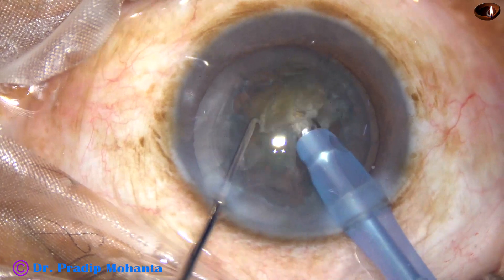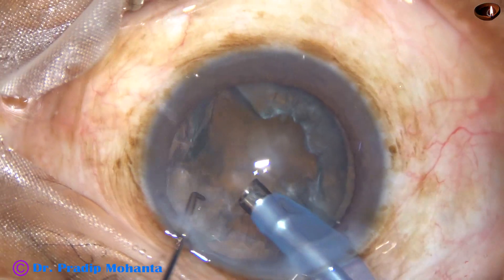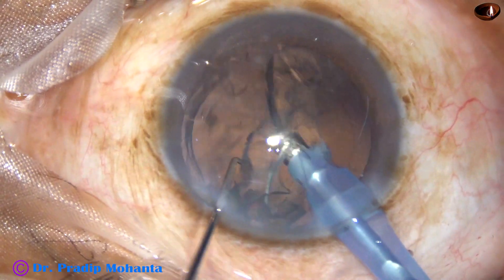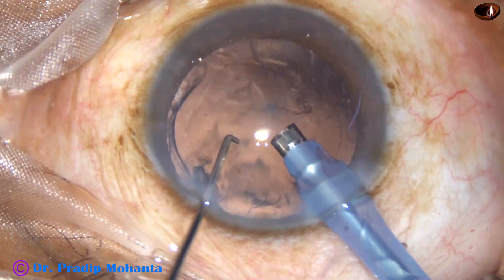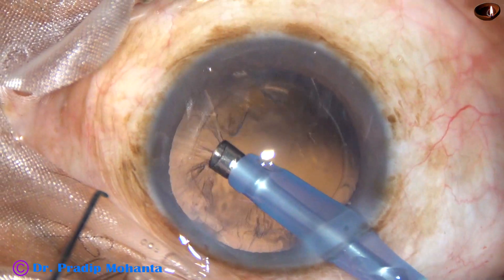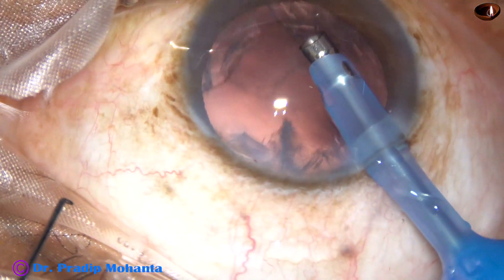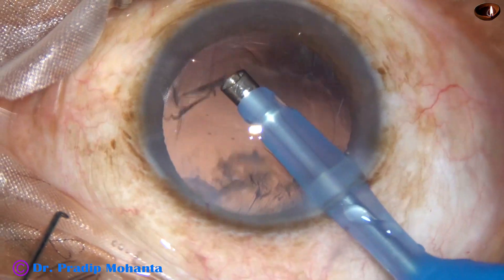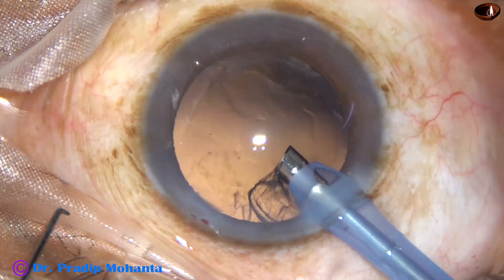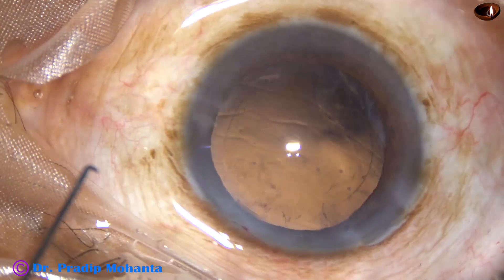The chop is done. Now, management of the epinucleus: always be very careful to hold the anterior part of the epinucleus — the part just under the anterior capsular rim. In this case, I removed most of the cortex with the phaco needle itself. At this time I am not in ultrasound mode; it is in IA mode.